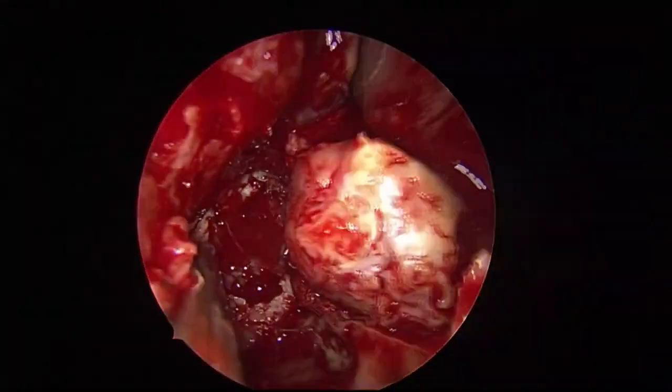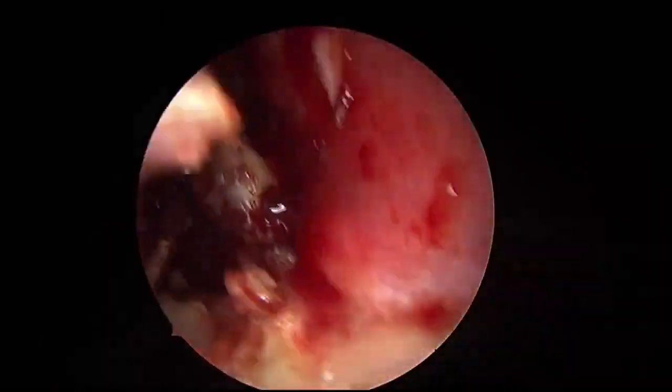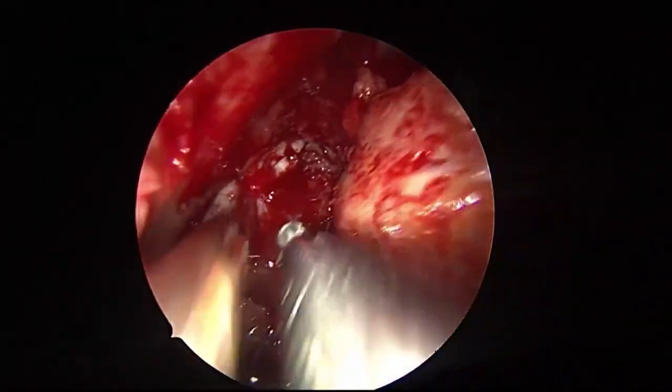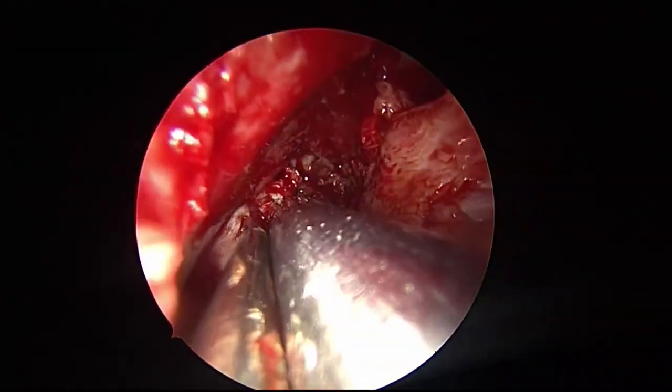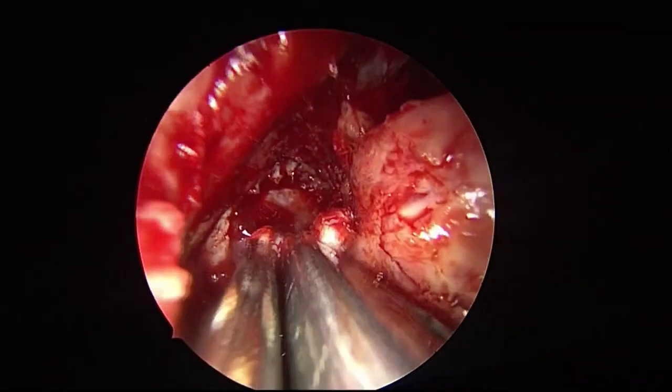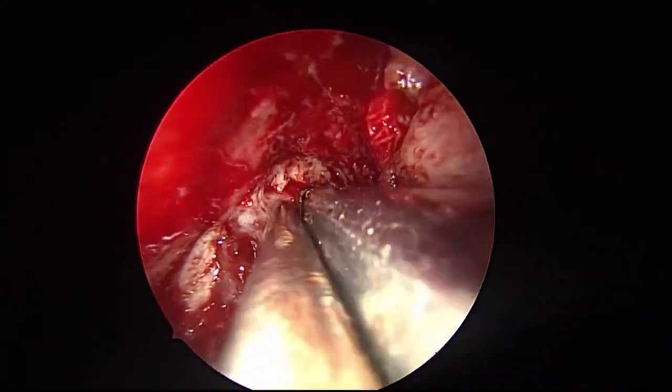You can already see the vessel, I think. Oh, I have not seen. No, that is on the periosteum. That is not the IMAX. The IMAX is behind the periosteum. Behind the periosteum.